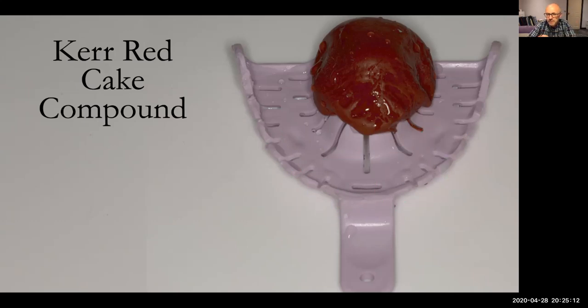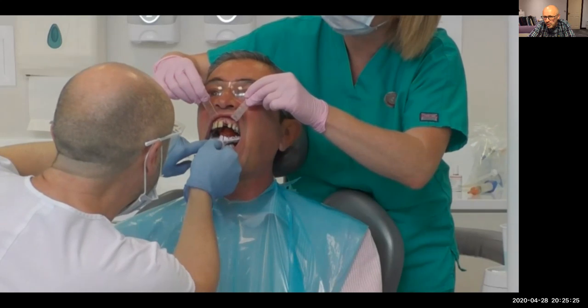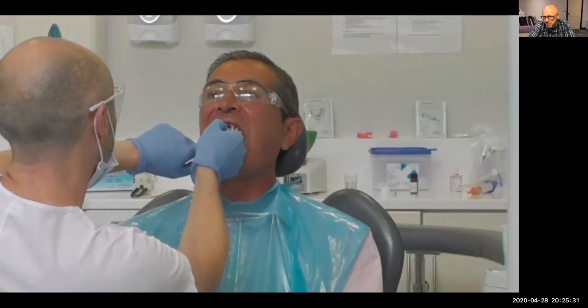I'm going to take this to the mouth now. So that red cake is soft. Here's Joe, and we're going to do that impression. Look here. Rotate it in. Sit it up on the palate. Rotate it up till it's just shy of touching the teeth.